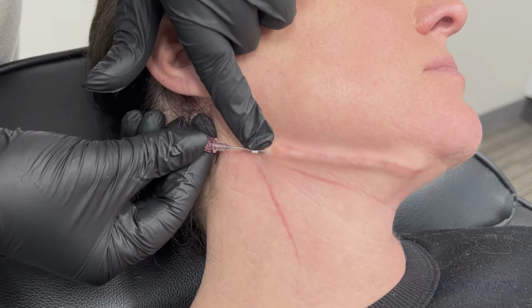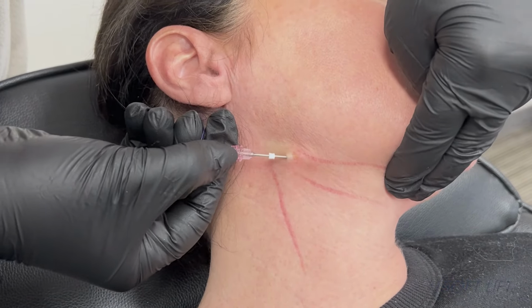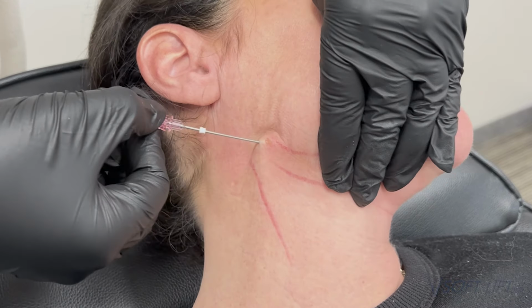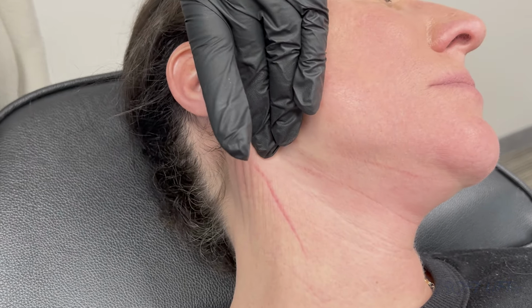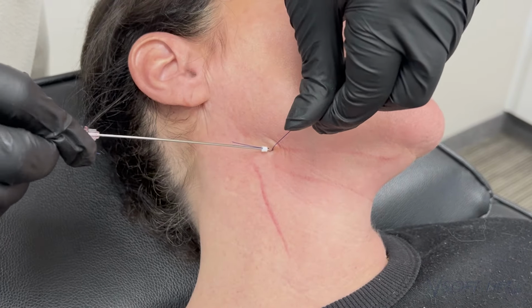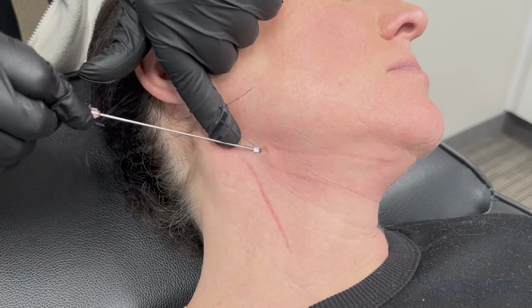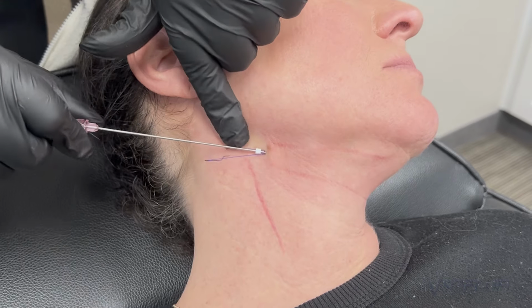And as you can see, I basically just guide it in, I hold the tissue taut, and I give a little wiggle and a push as I'm advancing. And you can see every little movement as I go in further. I stop, I pull up on my needle to tent and see what plane I'm in, ensuring that I'm staying in the proper plane the entire time I am advancing the thread.